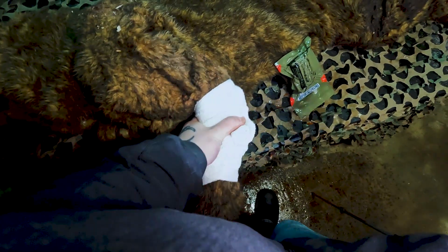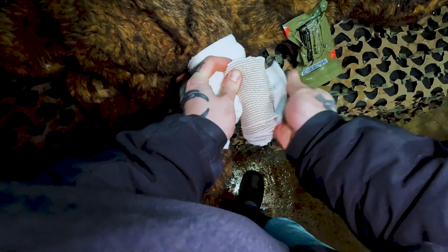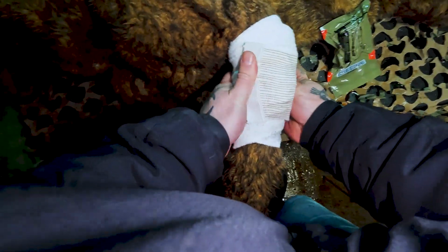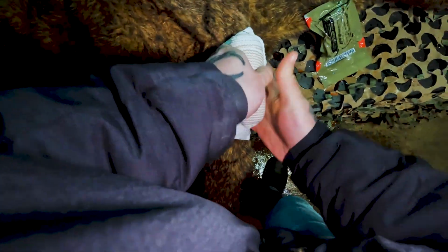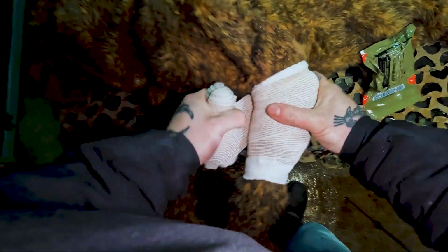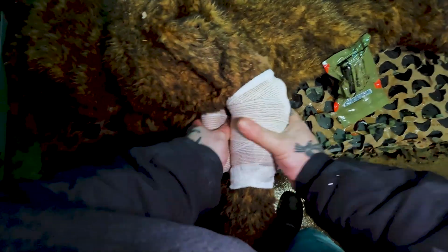Once you have the gauze wrapped around, you always want to try to keep pressure over the injury. And then you're applying more tension, making your own pressure dressing, with this being a compressible injury.